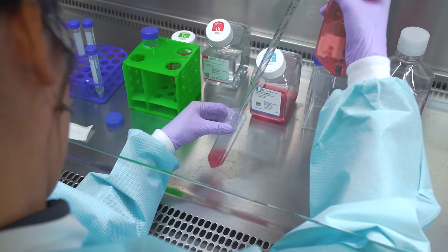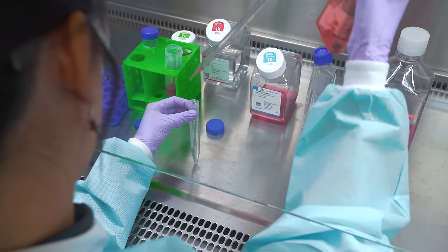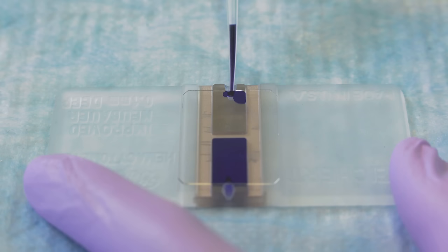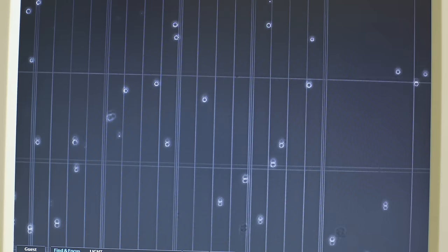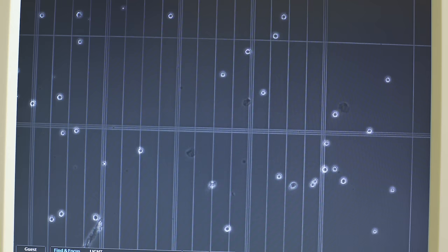Remove a small sample for cell counting. Trypan blue is used when counting cells to indicate the ratio of live to dead cells. The stain turns dead cells blue, but healthy cells with an intact membrane will remain white or colorless.